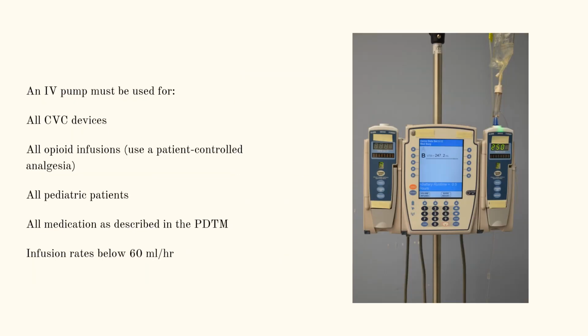An IV pump must be used for all CVC devices, all opioid infusions, all pediatric patients, all medication as described in the PDTM, and infusion rates below 60 mLs per hour. And here's a picture of one type of IV pump with two channels on the side.